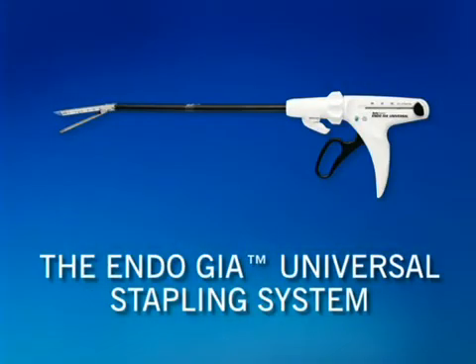This in-service video will provide you with basic instructions for using the EndoGIA Universal Stapling System from AutoSuture. Please refer to the instructions for use packaged with the product for more information.